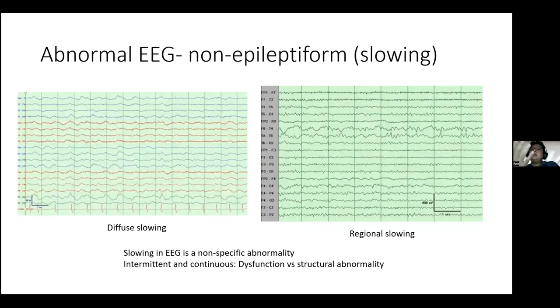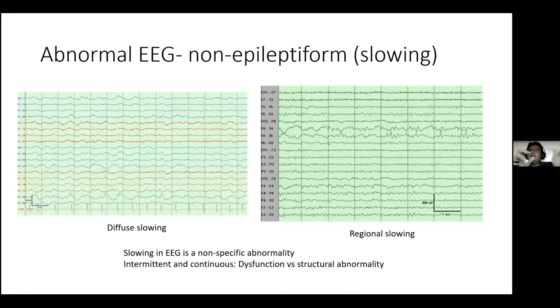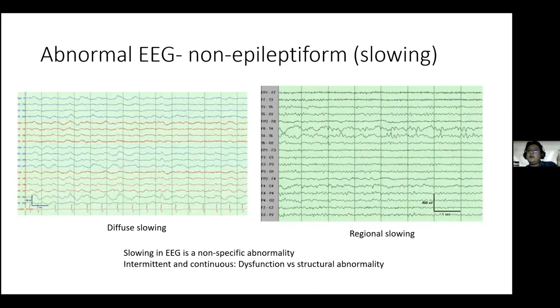Slowing in EEG is a non-specific abnormality — it never tells you the etiology, only how well the brain is functioning. Slowing can be intermittent or continuous. Intermittent slowing points towards a dysfunctional cerebrum, while continuous slowing makes you think of structural abnormality like a stroke.